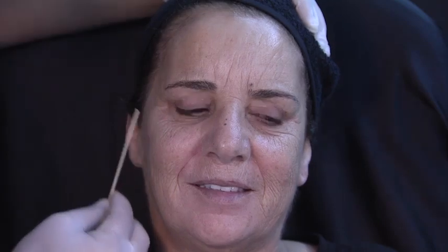Could we have her smile, please? Yes, can you smile? Somebody's asking if it's changing the smile. Smile. Okay. All right, good. Now it looks clear, the improvement also of those lines as well. You know, these lines by doing this treatment without over volumizing. Remember, this is what we're showing. No over volumizing. Okay. So I'm going to use the classic Restylane, the one that we know from a long time ago.